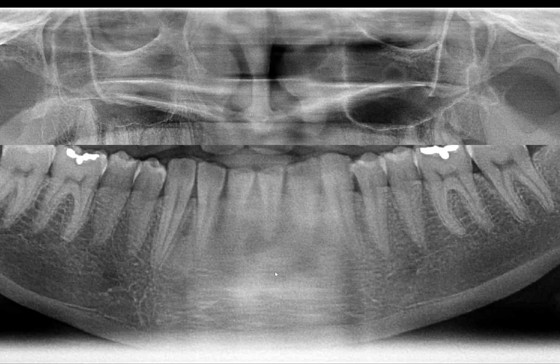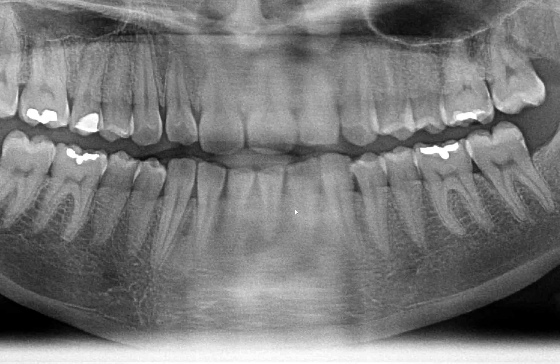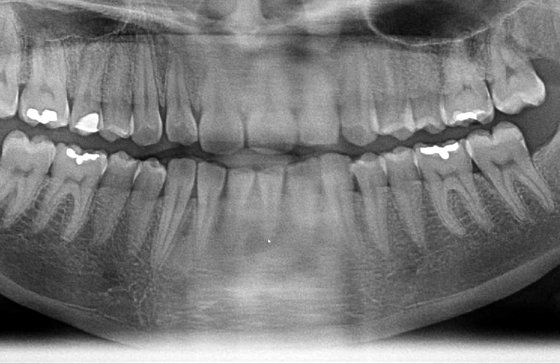Let me zoom in a little bit more. Here we have canine, lateral incisor, central incisor — so that's tooth number 24. Do you see that there is a radiolucency that appears to be relatively centered around tooth number 24?